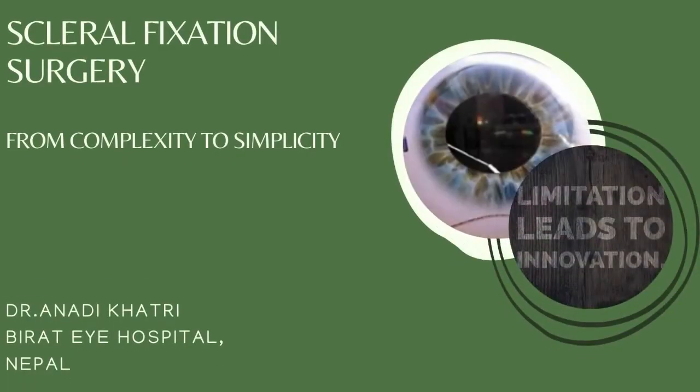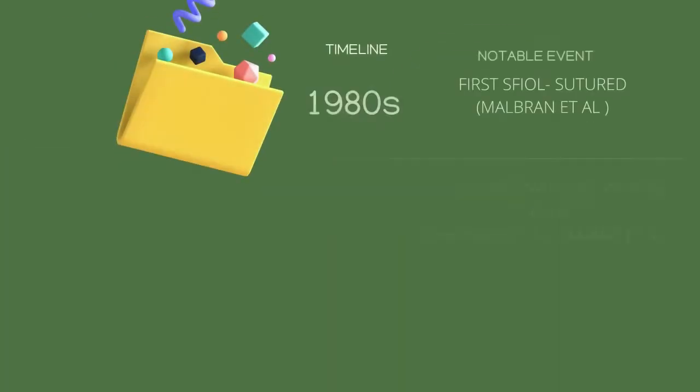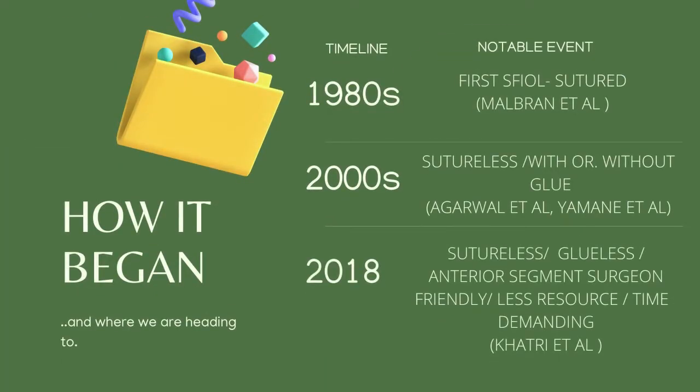Various surgical techniques have been described for a scleral fixated IOL since its time of inception. It has moved on from suture to sutureless techniques in the 2000s. In 2018, we described a surgical technique which not only made the procedure sutureless or glueless, but also more anterior segment surgeon friendly with less time and resource demands.